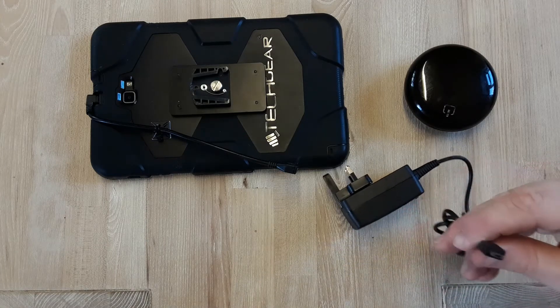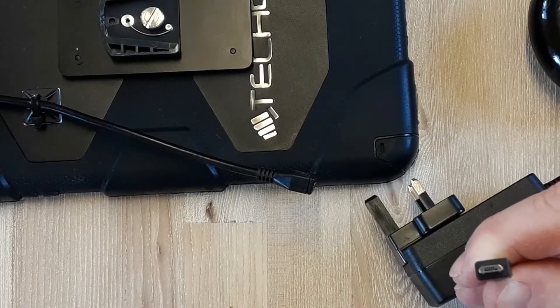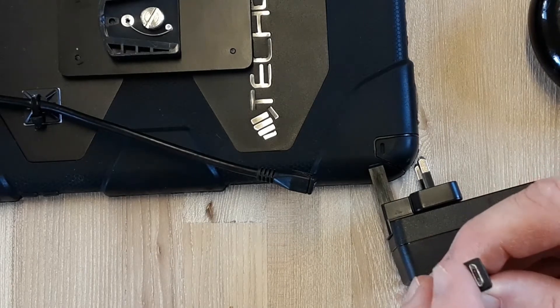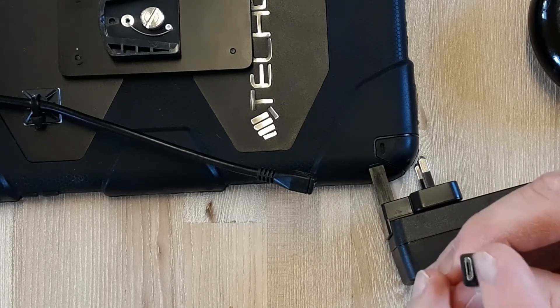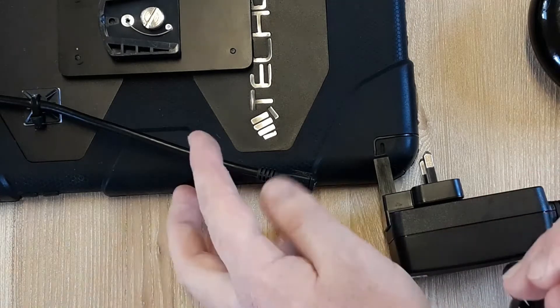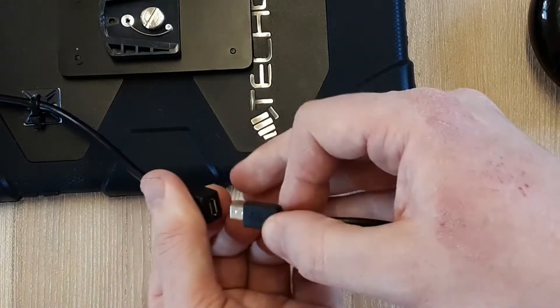As mentioned previously, we use a micro USB input. The micro USB input has two sides: a flat side and a slightly curved side, so it resembles the shape of a D. Please make sure that these sides are matched up correctly.